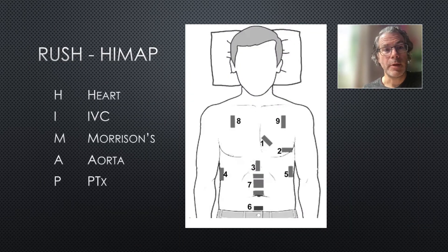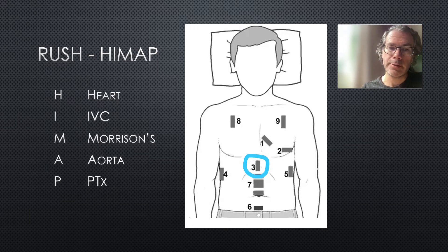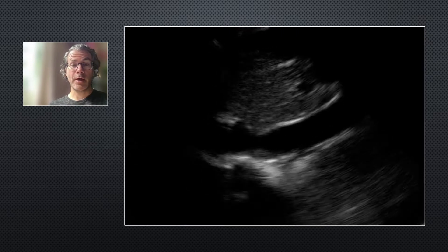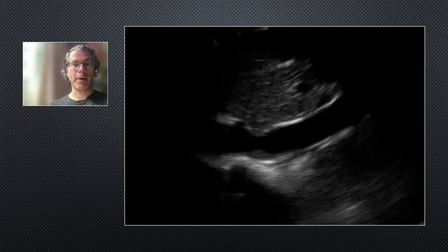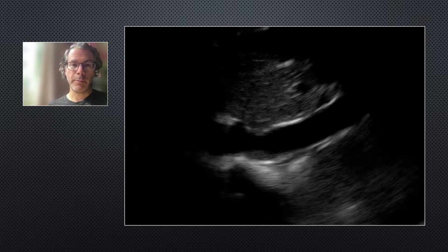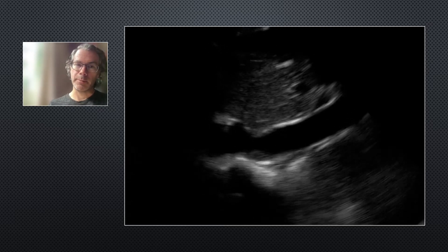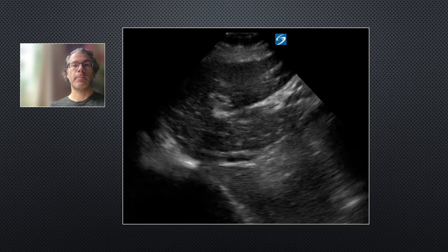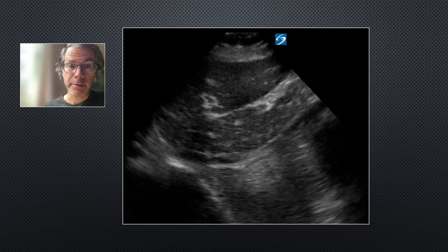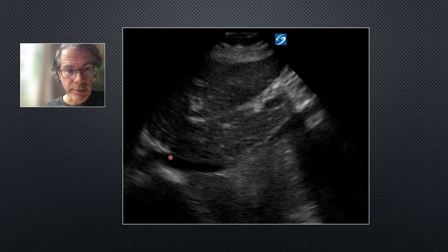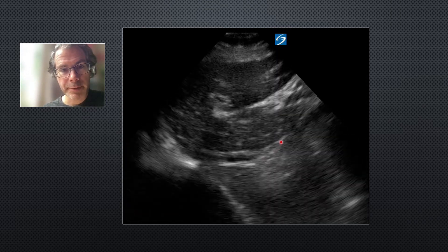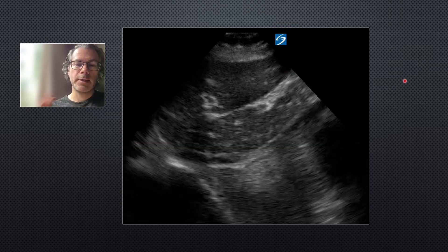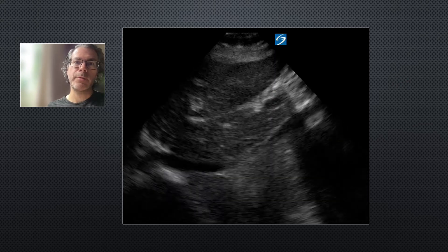The next step of the HIMAP exam is I for IVC. We put the probe just below the xiphisternum and slide slightly to the patient's right-hand side. Here's the IVC of our 15-year-old patient in long axis — it's more than two centimeters in diameter and not collapsing much with respiration, so this is a plethoric IVC. At the other end of the spectrum, a slit-like IVC that is narrow and collapsing is suggestive of hypovolemia.